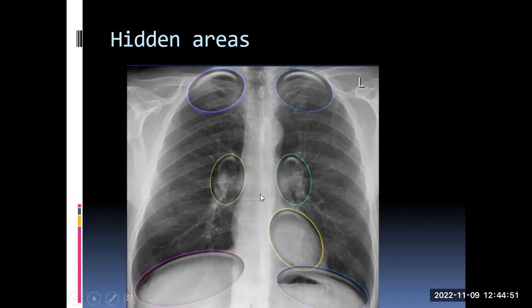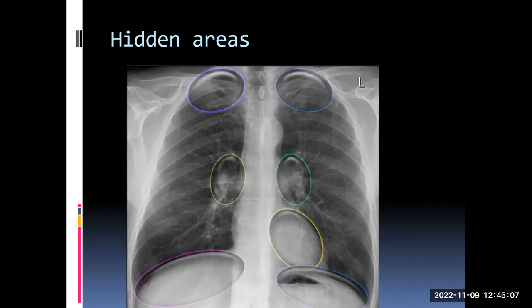Then comes the retrocardiac area. The heart lies very anteriorly in the chest cavity — the anterior body of the heart is actually touching the anterior chest wall, so there is no space for anything in between. Whatever shadows you see superimposed on the heart can safely be assumed to be behind the heart. That is why we call this the retrocardiac area.